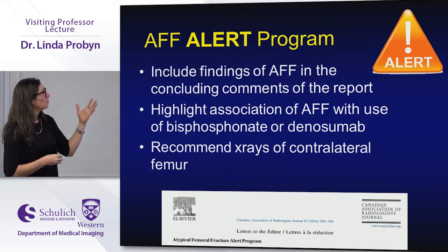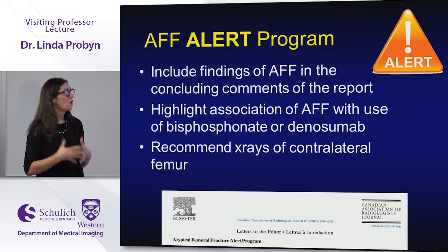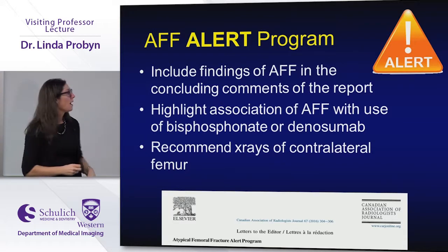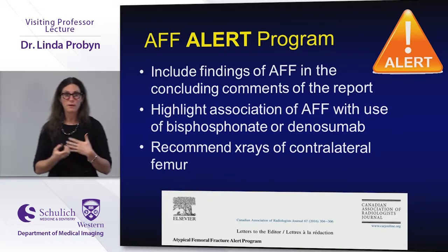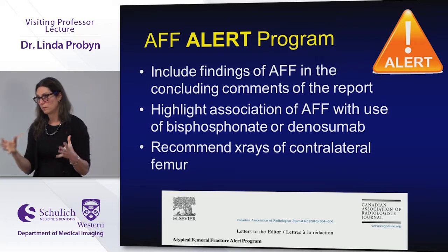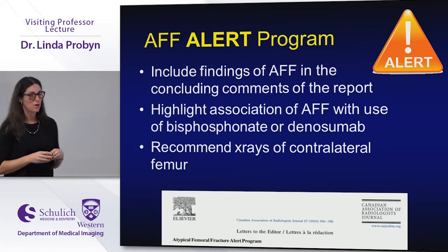So this ALERT program, these are the important features of it. We want to include findings of atypical femoral fractures in the concluding comments of the report. They need to know it, they need to see it, it has to be pretty clear. They want a highlight of the association of atypical femoral fractures with the use of bisphosphonate. So I always say, this kind of fracture is typically seen with bisphosphonate use. Please correlate clinically or something like that to certainly spark their attention, and recommend x-rays of the contralateral femur.